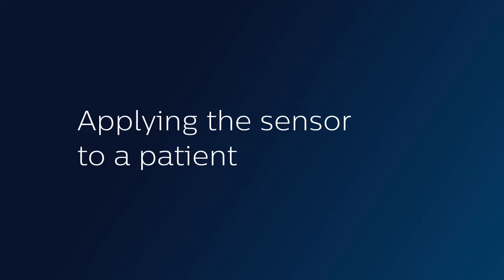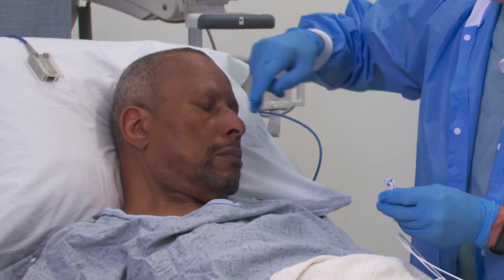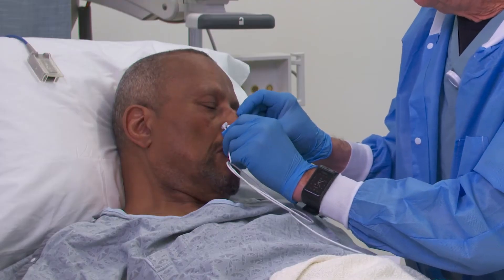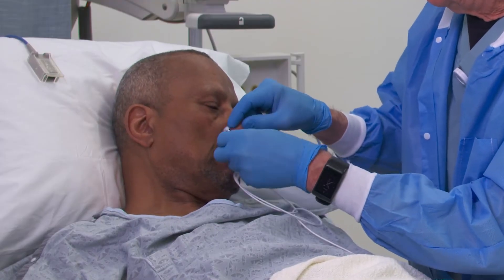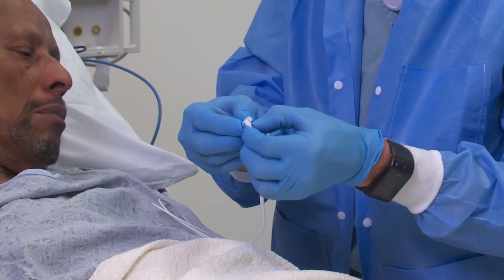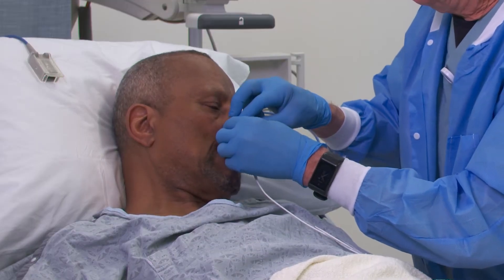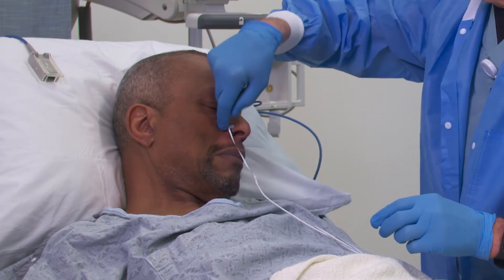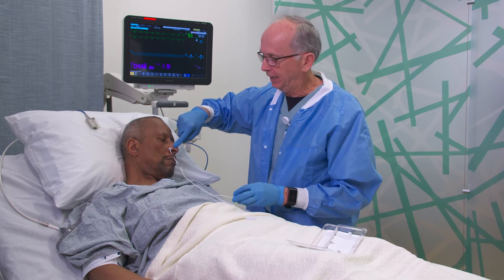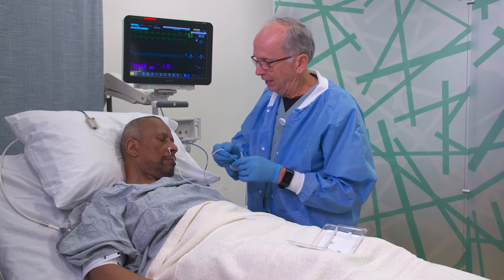The nasal alar sensor is placed on the nasal ala, the fleshy part of the nose up against the cheek. It can be done with an applicator, or simply by popping it open and sliding it in. You'll notice it's placed literally against the cheek — when you go further out you are more vulnerable to lower perfusion and changes associated with temperature and medications.